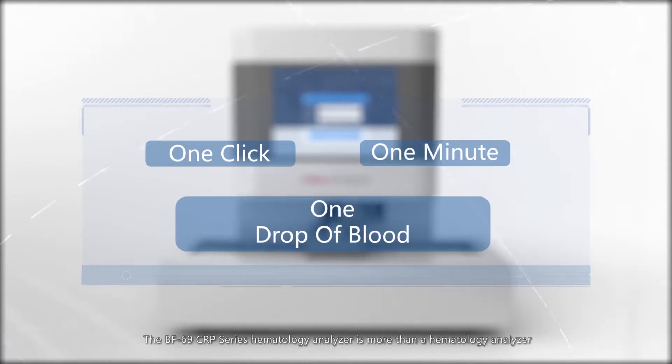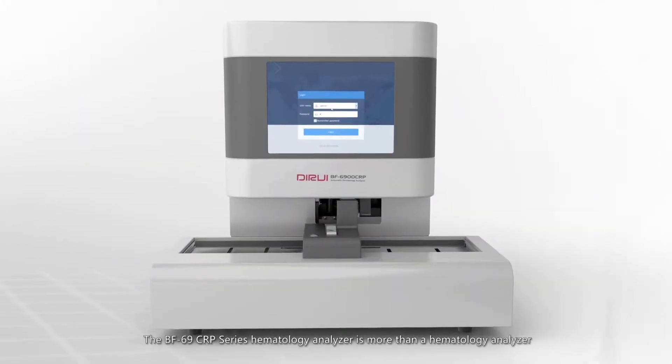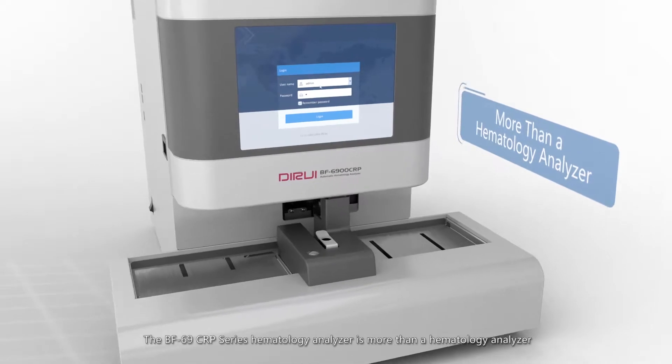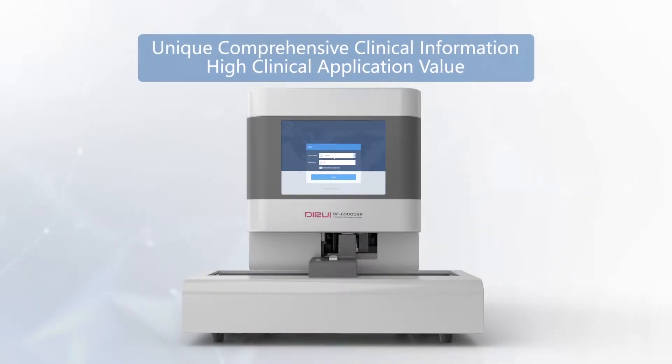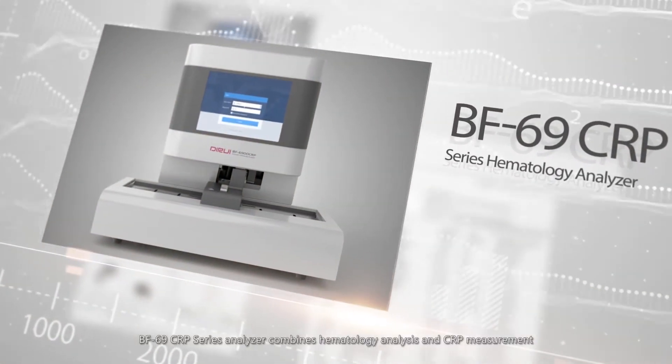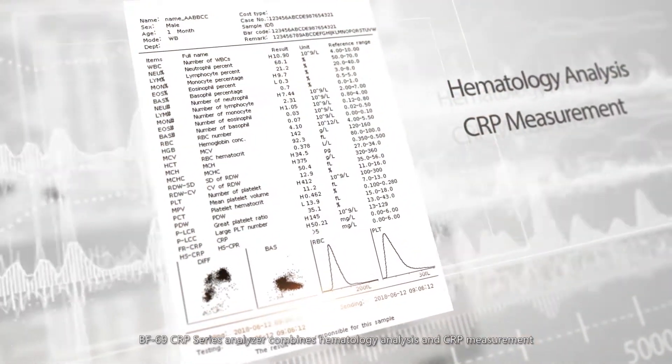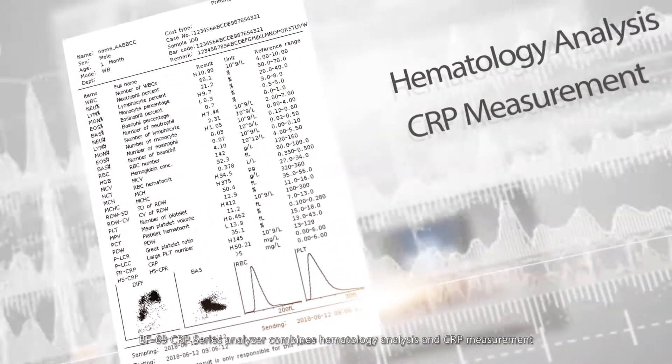The BF69-CRP Series Hematology Analyzer is more than a hematology analyzer. Unique comprehensive clinical information, high clinical application value. BF69-CRP Series Analyzer combines hematology analysis and CRP measurement.